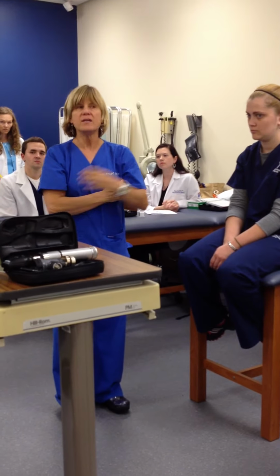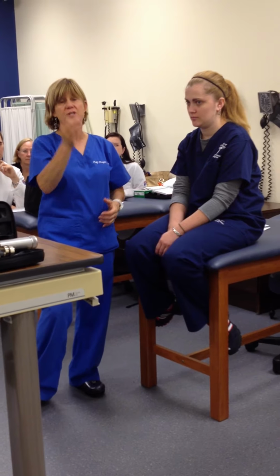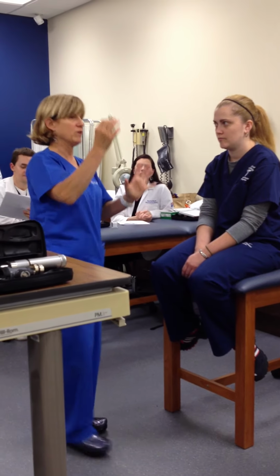So you'd have to get over that iris. That's where you touch it. In a real exam, do we do that touching or just assume you are doing that? In the exam for our class, you're going to do everything except touch, because we're going to spare our patient models, okay? But in reality, with a real patient, you would touch and get the corneal reflex, yes. For the sake of the exam, you just come near it, don't touch it. You're going to have the cotton and everything in your hand as if you touched it, but you're going to get about that far from it and not touch it.